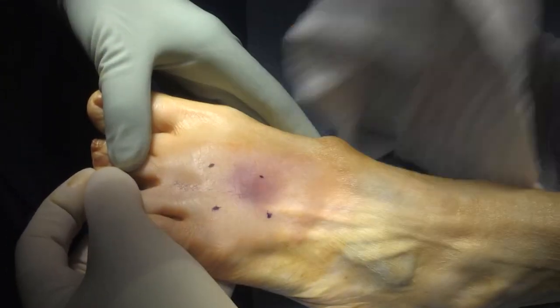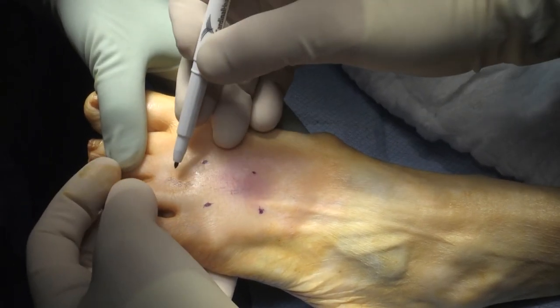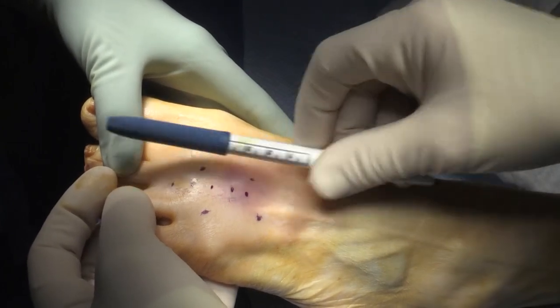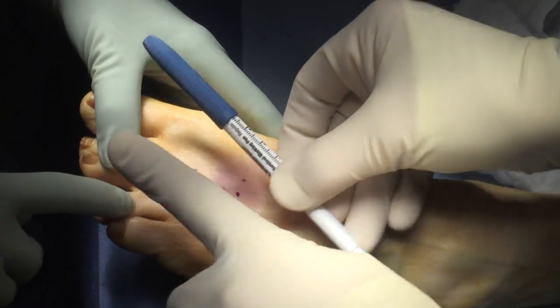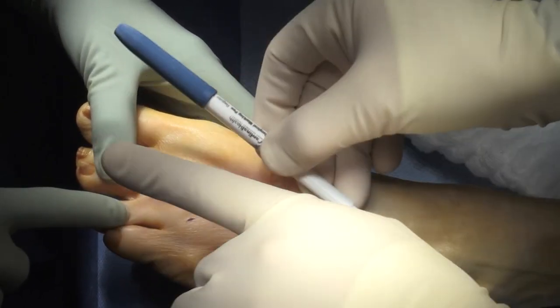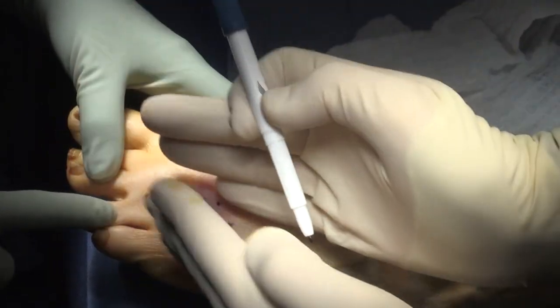So that incision was actually quite good. I kind of go into the web space, so this is where I would want to go, something just like this. Because I want to be — it's very easy to get this incision oriented one way or the other relative to the metatarsals. If you want to extend this up, you've got to go between the metatarsals, so there's no sense in being oblique to them.